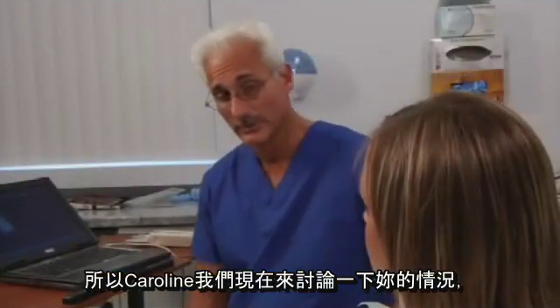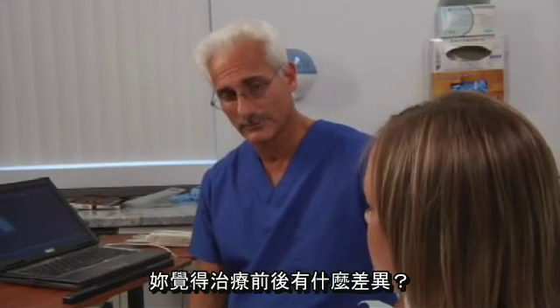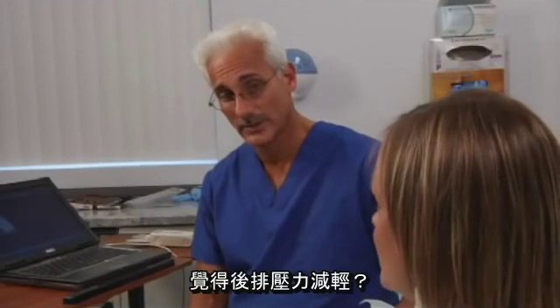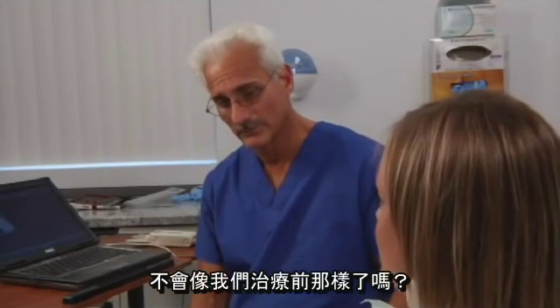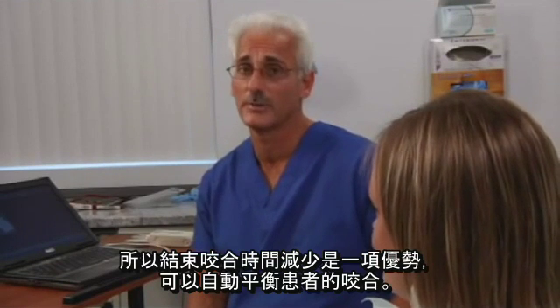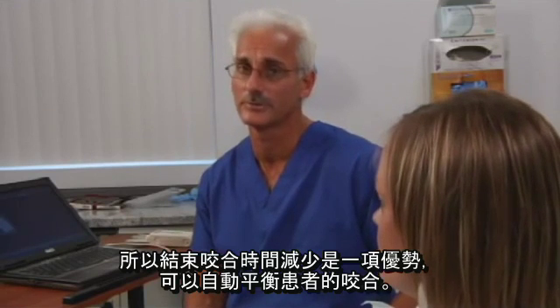So Caroline, now that we've straightened out your occlusion, what's different about it? How does it feel different than from before we treated you? It feels a lot different. It feels good. Definitely aligned better. I can feel it in the back, less pressure. So it feels lighter in back? Yes. And does it feel like you can close and your teeth fit together? Yes. And did it feel like that before we did this? No. So that's one of the advantages of disclusion time reduction. It automatically balances the bite and closure for the patient, speeds up the process of doing occlusal adjustment therapy.